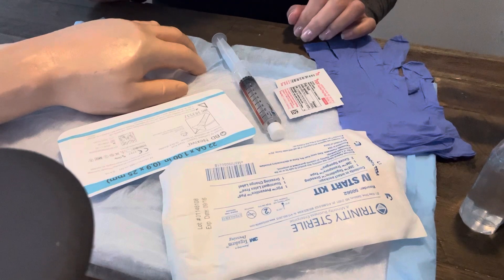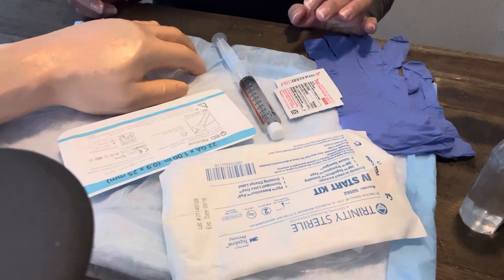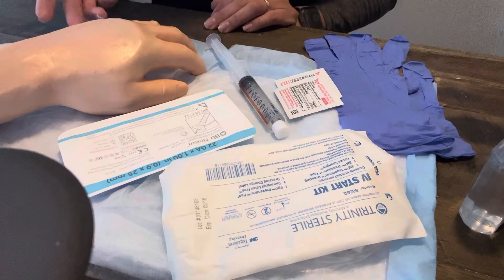Bear with my camera — I'm trying to do this without a tripod, so it's a little difficult. The basics are: you're going to identify your patient, check your doctor's orders, and ensure that you have an order to start an IV.